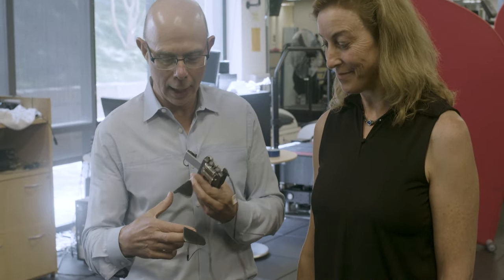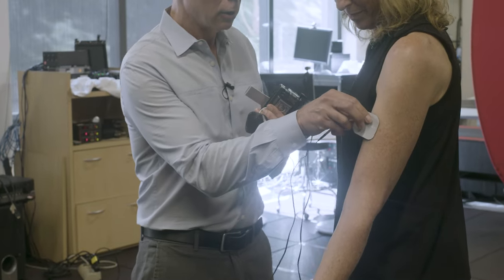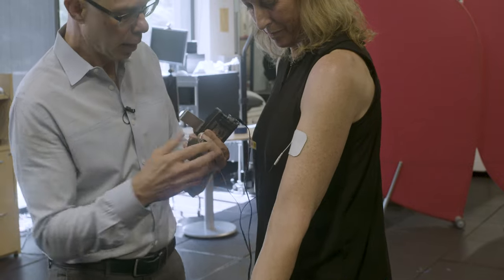I'm here with Julie Muccini, the clinical research manager in the human performance lab. And we're going to apply an electrode here to her biceps brachii.